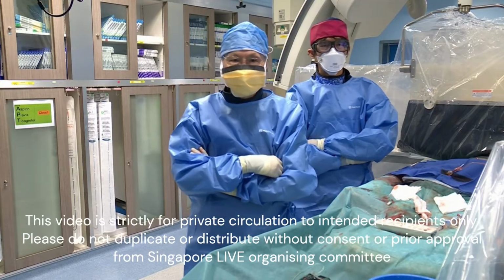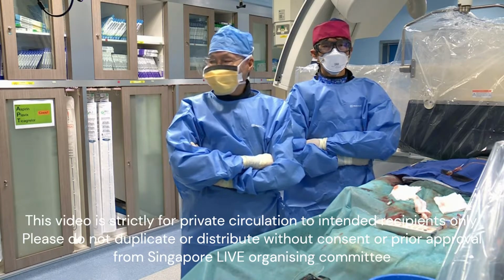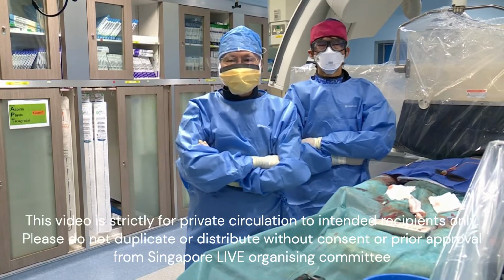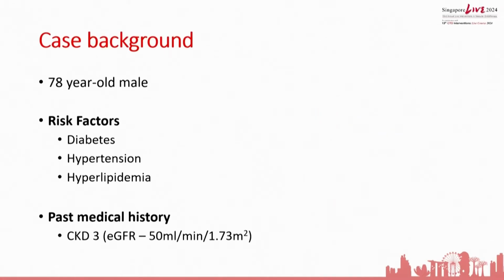I have with me Jonathan Yap, one of our up-and-coming interventional cardiologists, and also Sister Tina. Very fortunate to be able to have her here with me today. So we have an interesting case for you to showcase how we can reduce the amount of contrast for patients who have CKD. So without further ado, maybe I ask Jonathan to present the case.